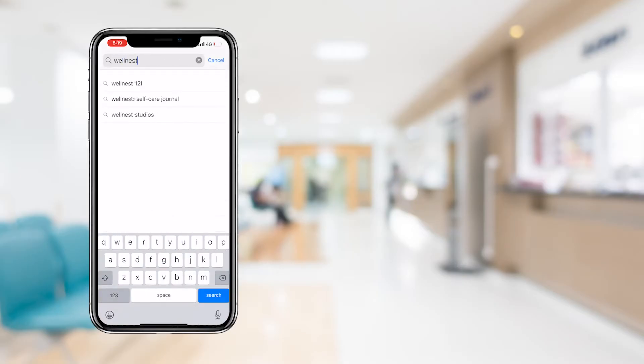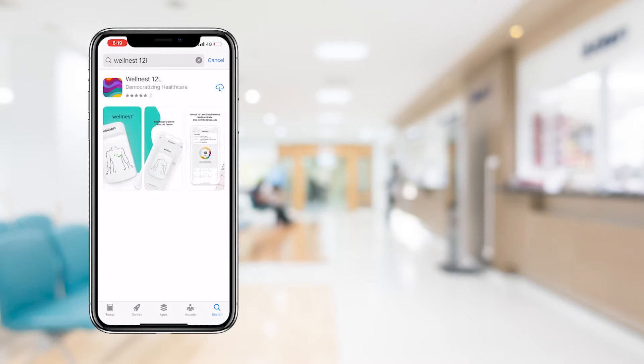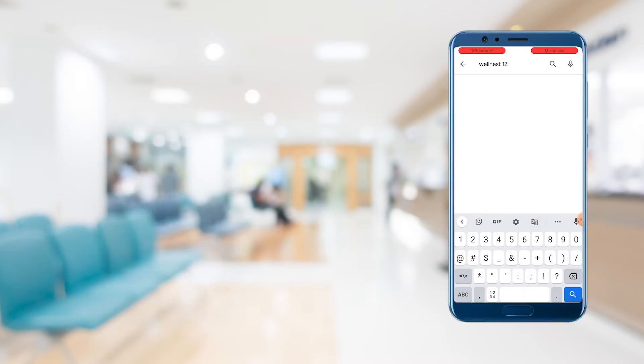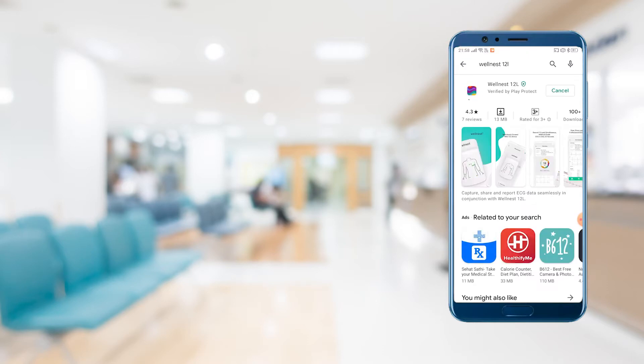Download the Wellnest 12L app from the Google Play Store or iOS App Store. Follow the instructions on the app to sign up or log in using your mobile number. It is recommended that all staff members involved in the ECG process download the app on their personal devices and create their profile. For more information, please refer to our segment on staff registration.